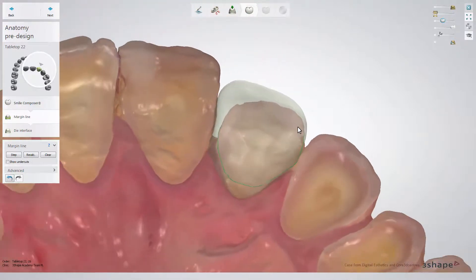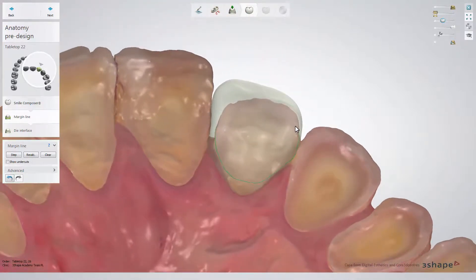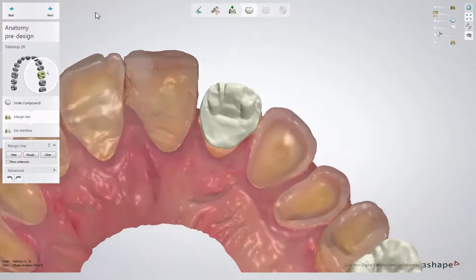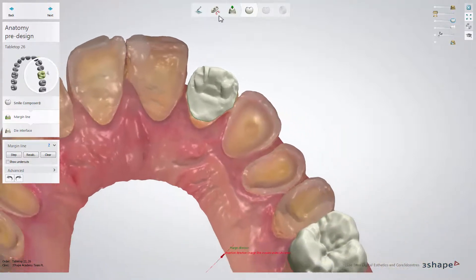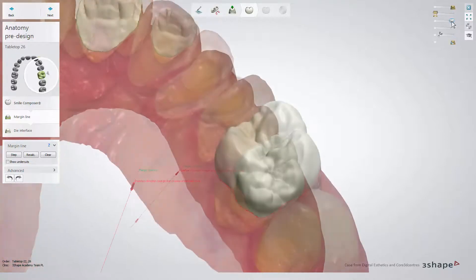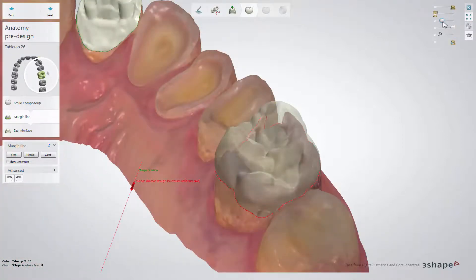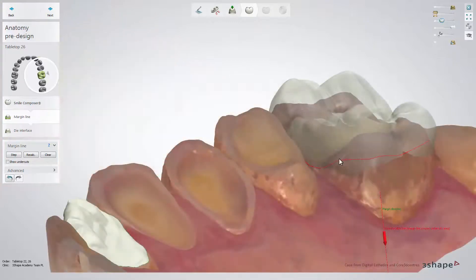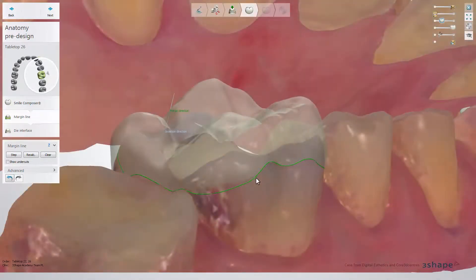After adjusting the margin line, click next to go to the die interface sub-step and adjust, set, or change parameters if needed. And if you design more than one restoration, repeat the same steps for the rest of them.